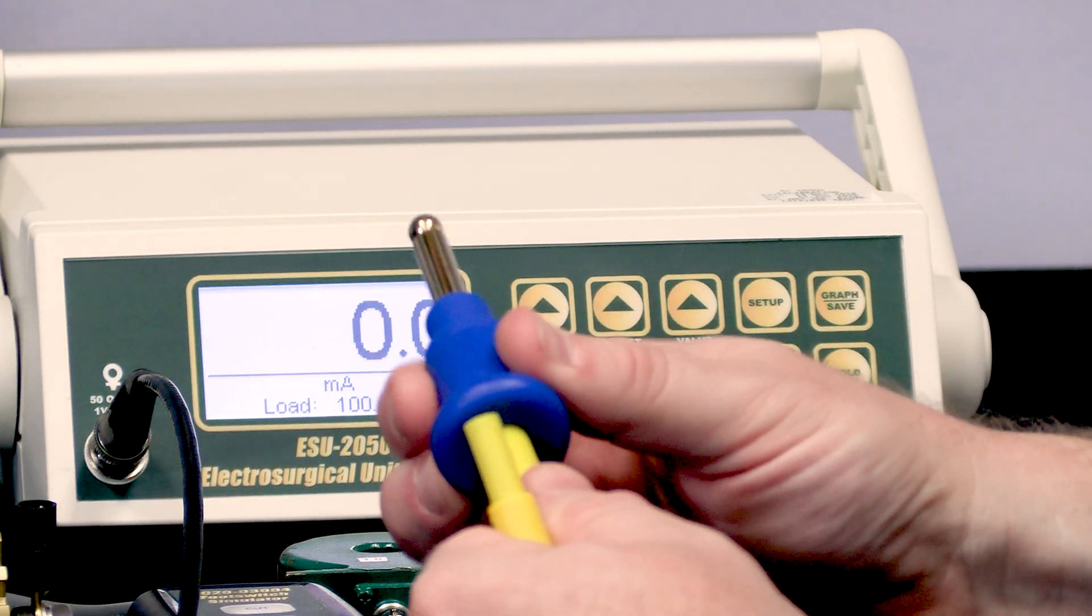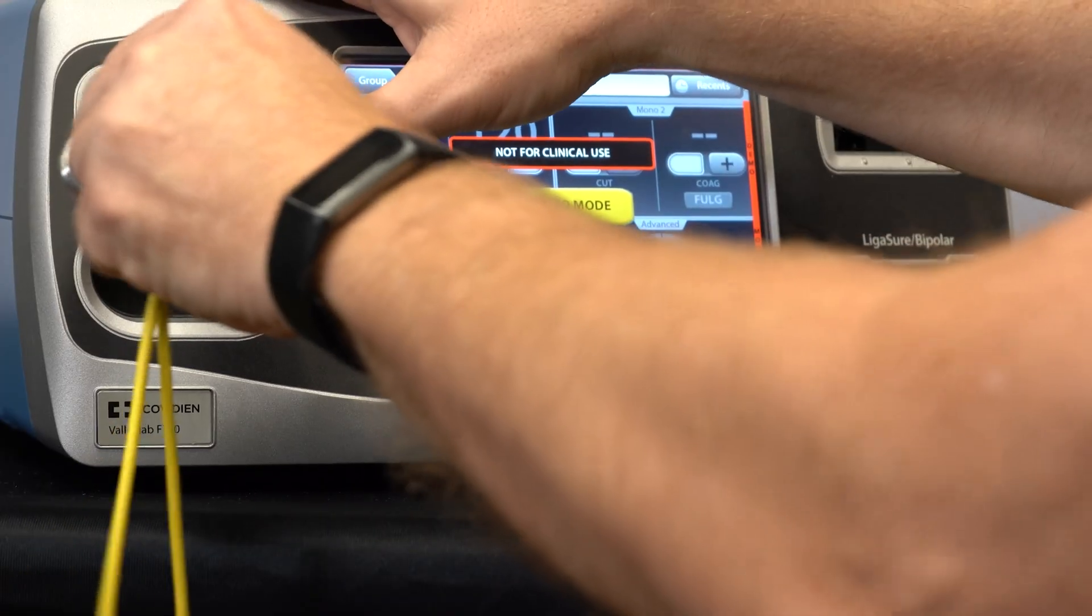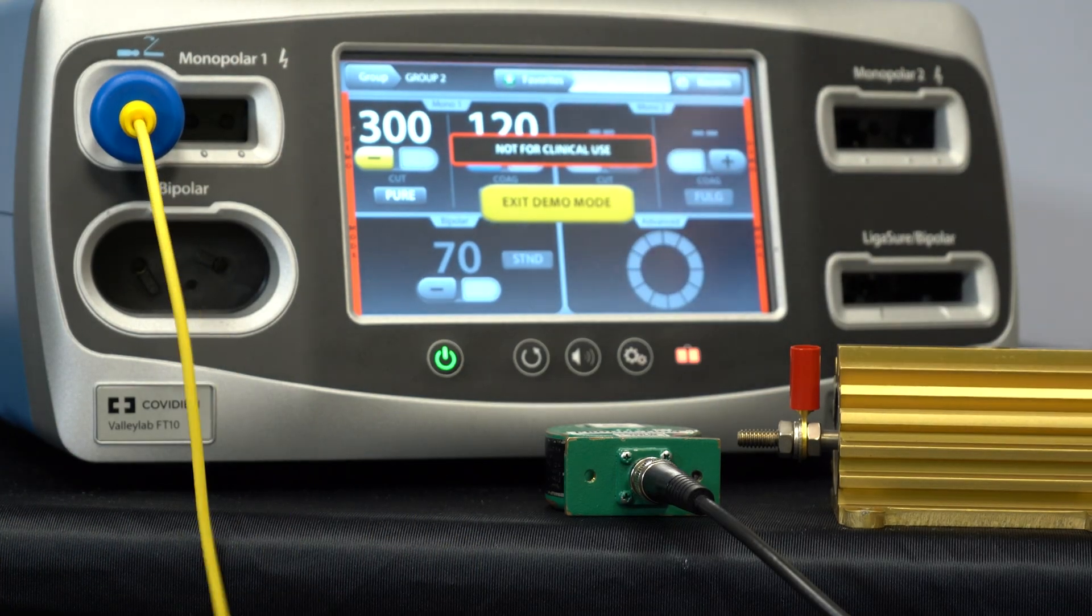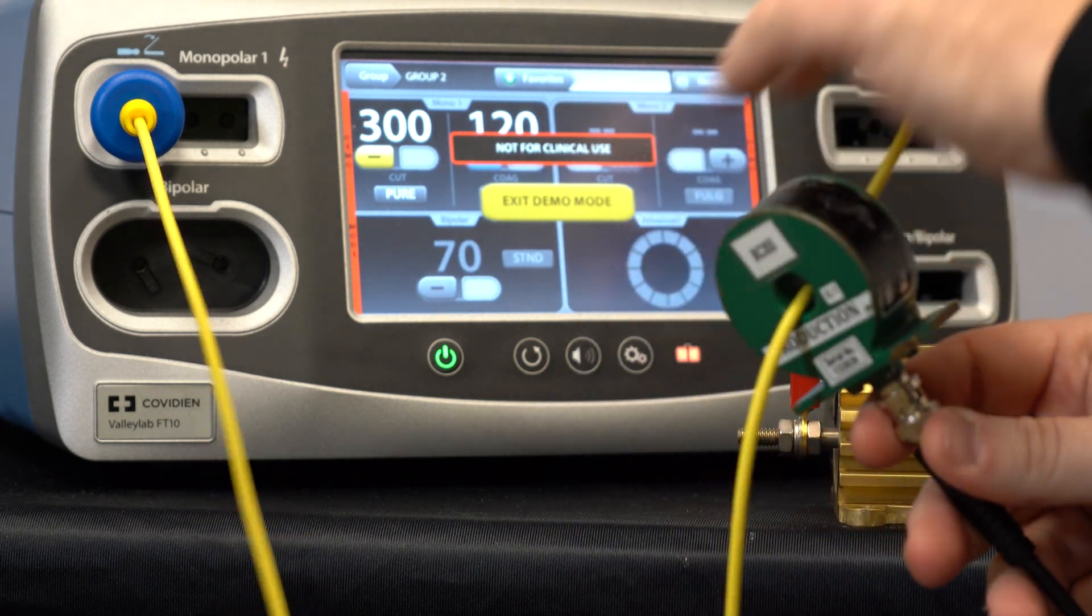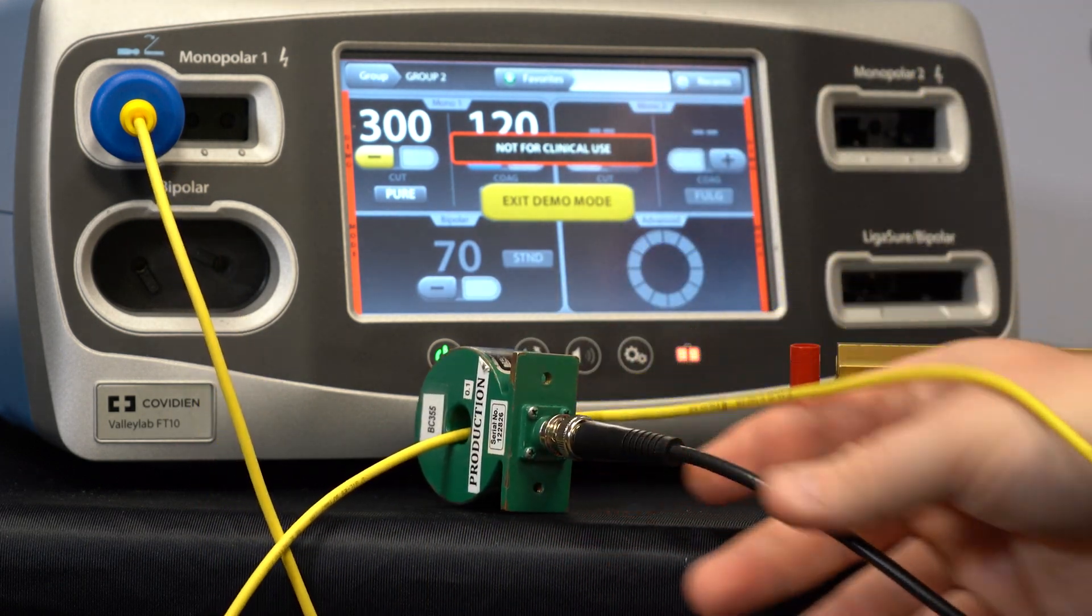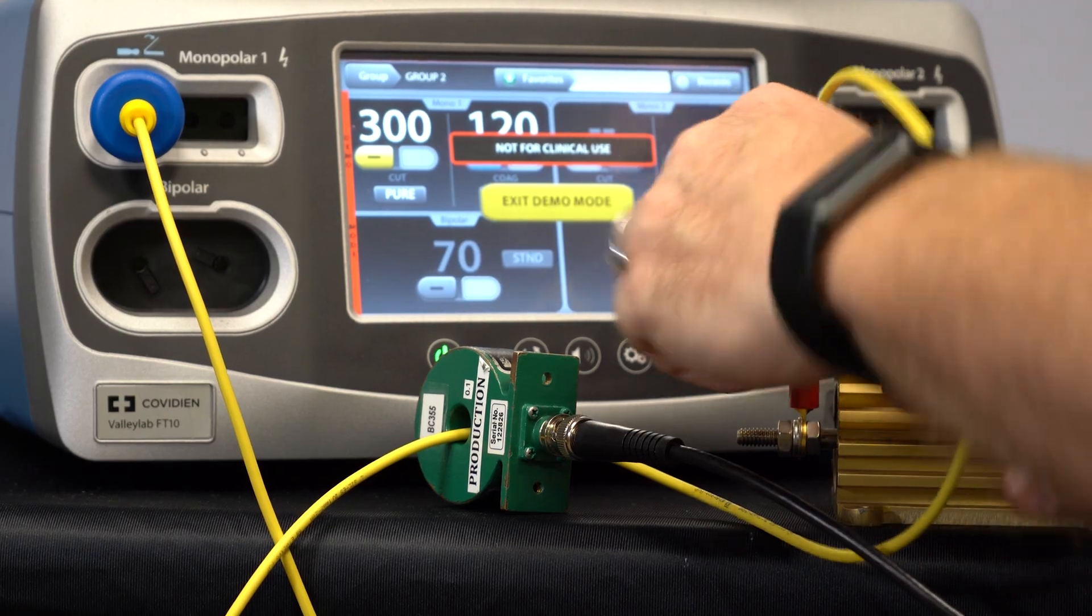We're going to take our active lead and plug that into the monopolar 1 port using that footswitch port adapter. Now I'm going to take the output, other end of the output cable, and go through the current transformer and into my load.